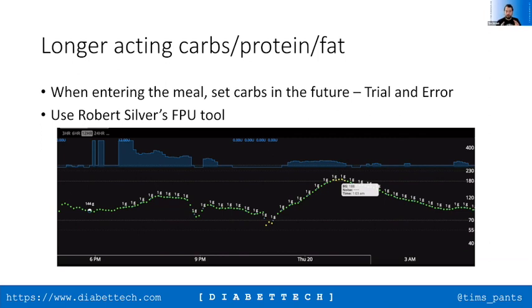But before you use e-carbs with Android APS, I would always suggest trying to use the algorithm on its own. What we see quite frequently is people coming in to use these platforms and then going, right, well, I used to use a temporary basal rate for dealing with my pizza. How do I do a temporary basal rate using Android APS, using Loop, using OpenAPS? And the answer is, let it have a go on its own first so you can figure out what you need to change.